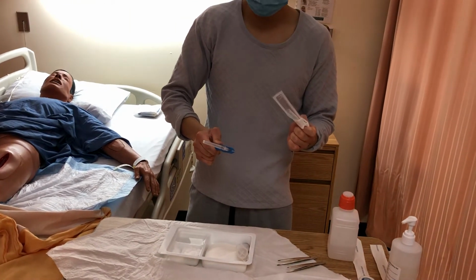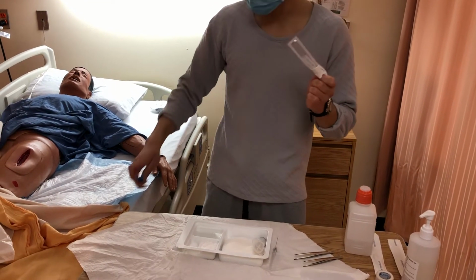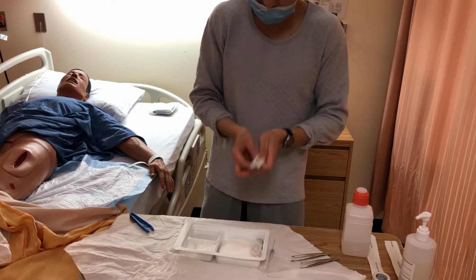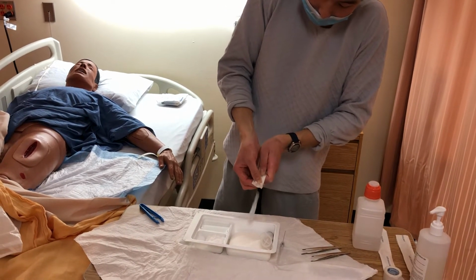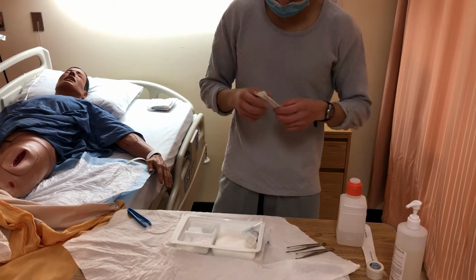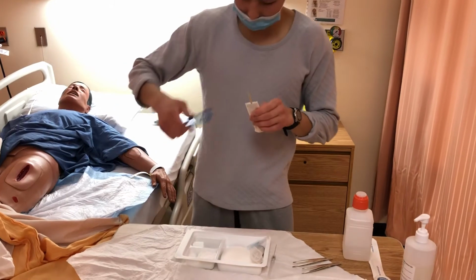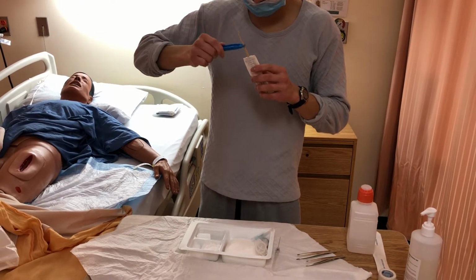So that IV Cathlon got damaged, but I would make sure to please assume that never happened, and I would make sure to get my buddy nurse, and he would bring me a new IV Cathlon, but I'm going to just continue to toss this into my sterile field. And now I'm going to get my cotton sticks. And then I would raise the height to waist level, but again for other purposes, keeping it at waist height.